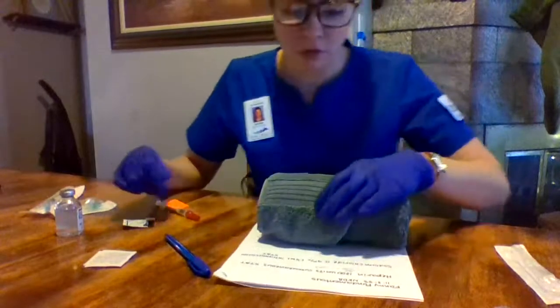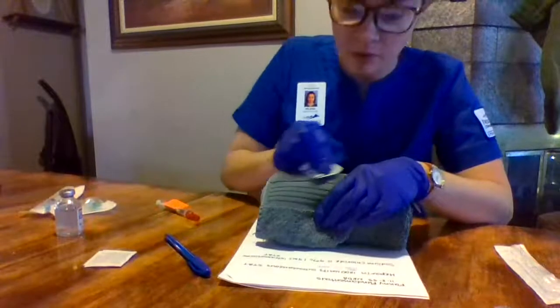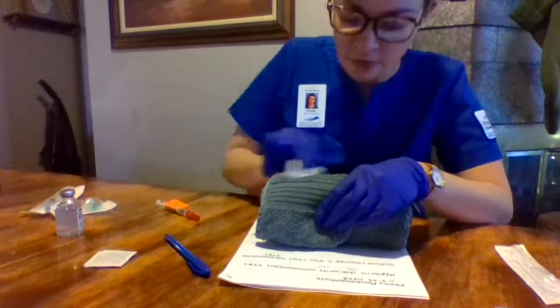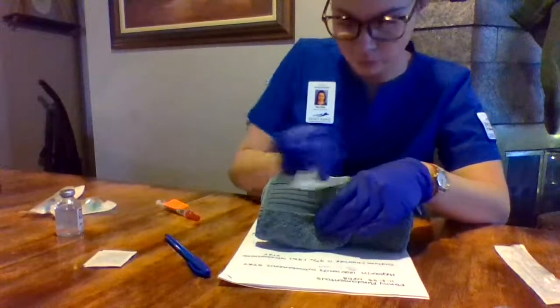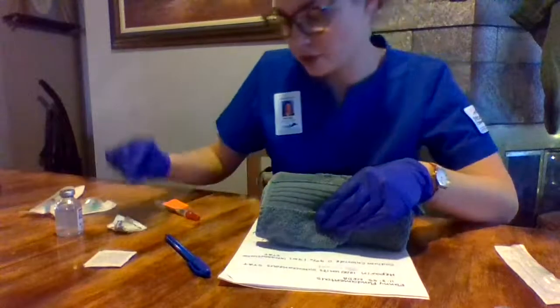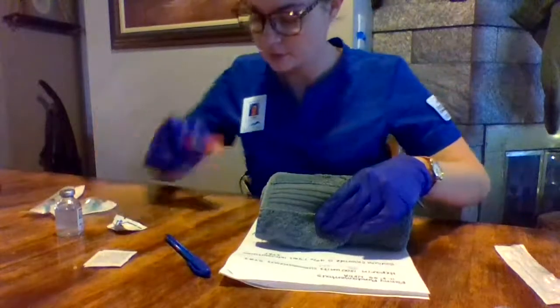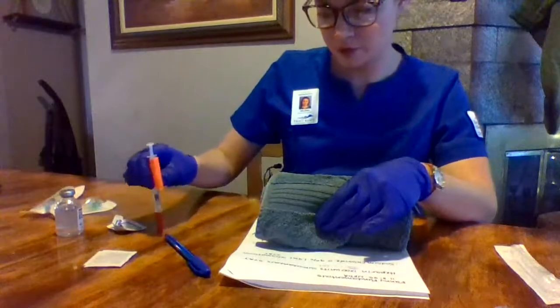So I'm going to bunch the skin, cleanse with an alcohol wipe starting in the center and moving outward in a circle. I'm going to let that dry. Then I will remove my cap from my syringe.